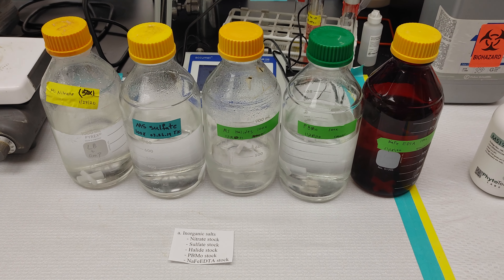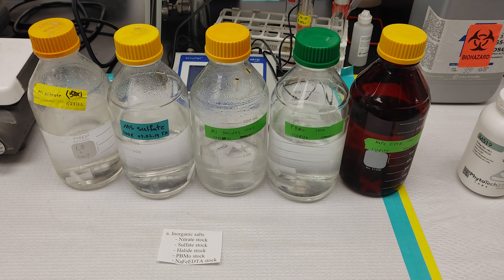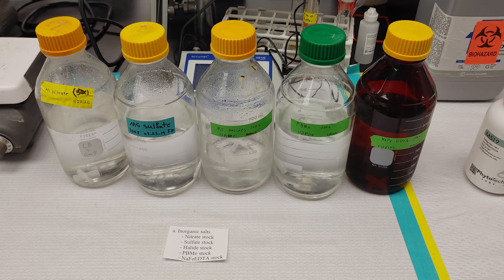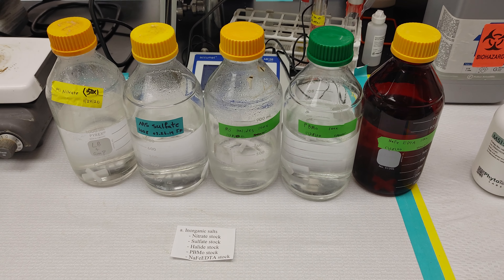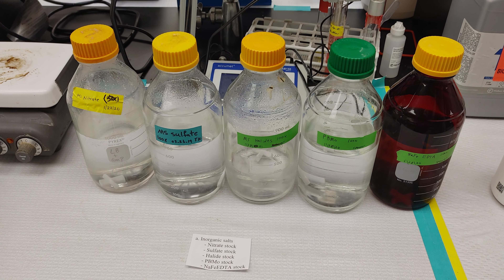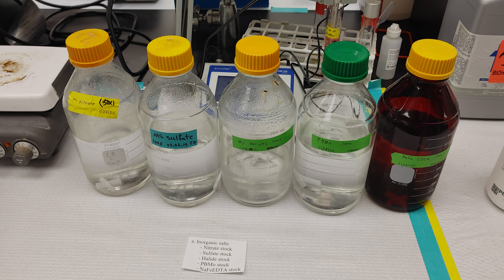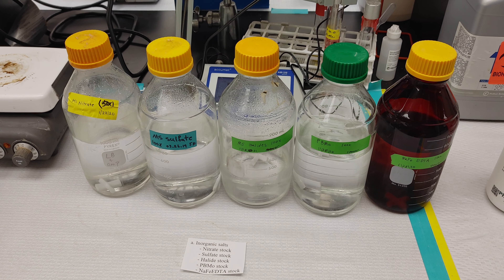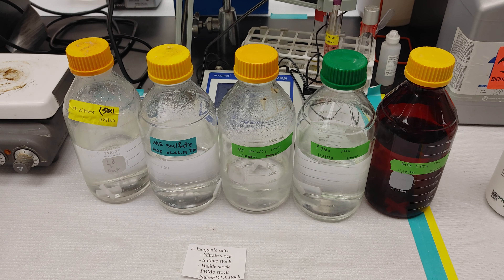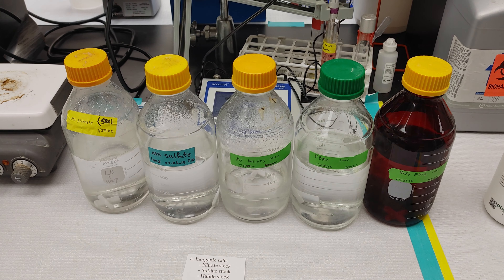These are the inorganic salts stock solutions that we use to create our media. These are a crucial part of the media because they will provide the plant the nutrients — these are the available nutrients for the plants to photosynthesize and grow.